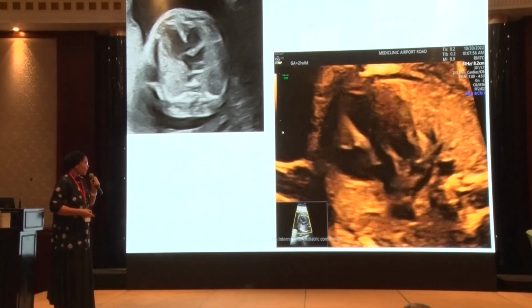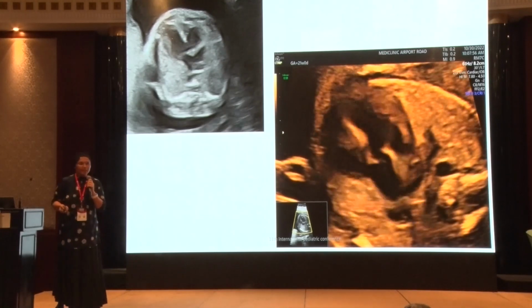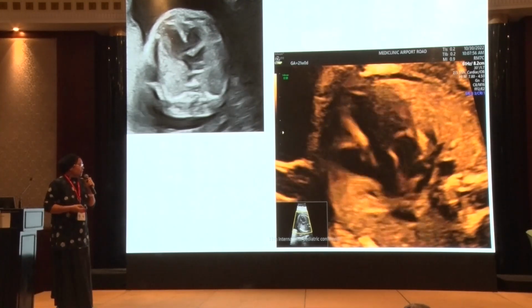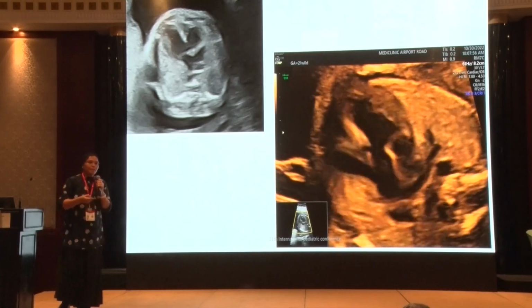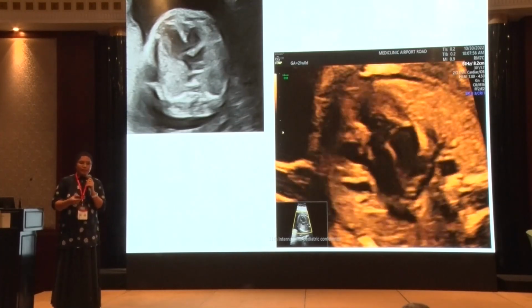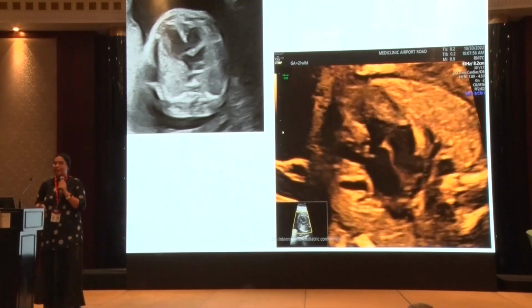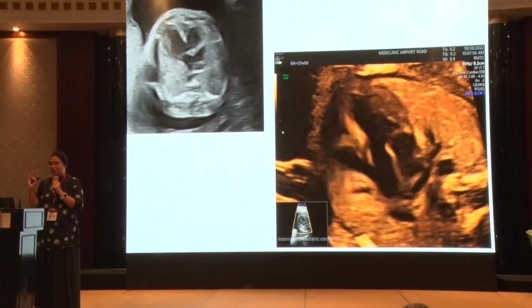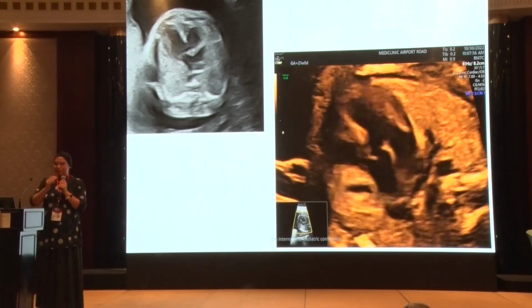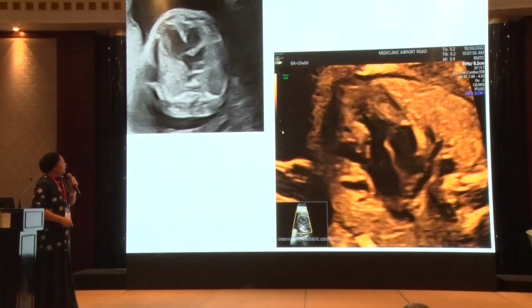So it is an overriding, and once it is overriding, normally we think it is an aorta, isn't it? So what are the multitude of possibilities once there is an overriding? It could be tetralogy, it could be DORV, it could be truncus. It all depends on where the pulmonary artery is coming from. That's the next clue. So this is the sequential steps that we are doing, yeah?